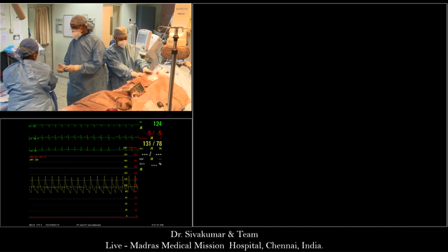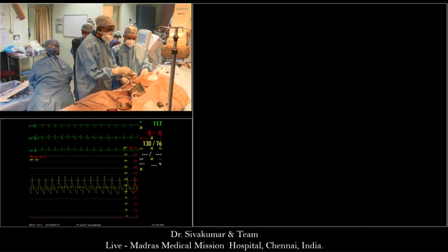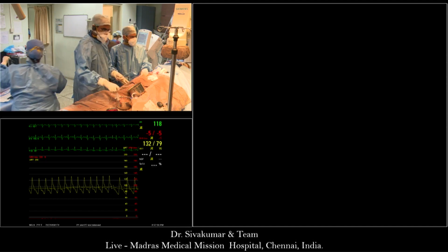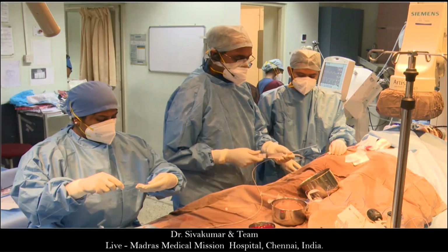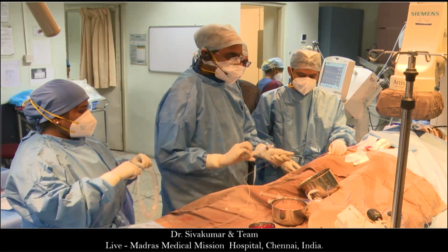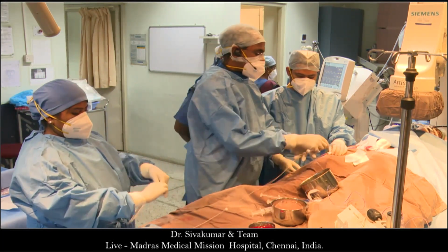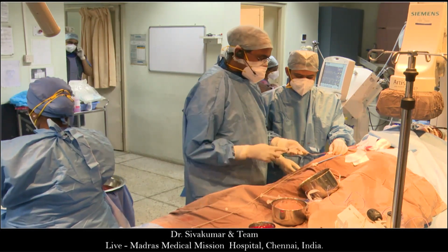What was the question? There wasn't a question. We're just asking, are you in the same pulmonary vein as you were before? No, it is in the lower pulmonary vein. I have gone into the lower. Actually, because of my repeated sheath manipulations, the Cook-Mullins sheath got a little bit kinked, so I had to change to another 14 French sheath.